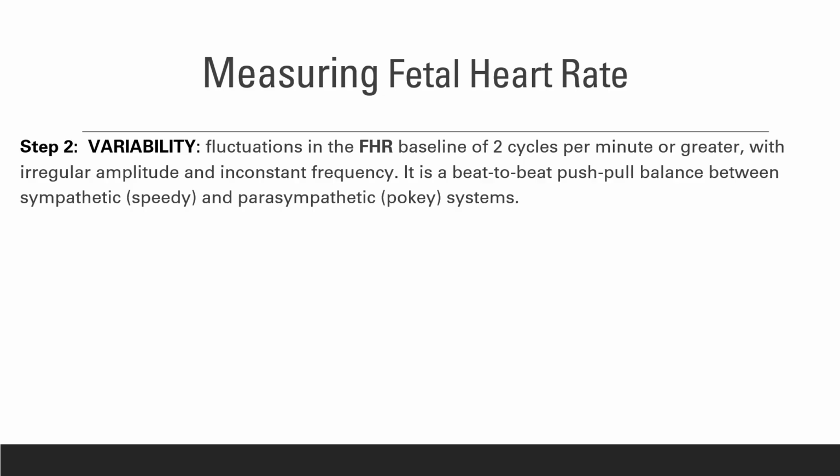So once you've established your baseline, your variability, and whether there's acceleration, the last step is to determine if there's any deceleration. A deceleration is a decrease from the baseline, indicating a complication ranging from normal to bad regarding fetal well-being. We will go deep into the deceleration segment in a little bit. There are good decelerations, and there are also bad decelerations, depending on the situation.